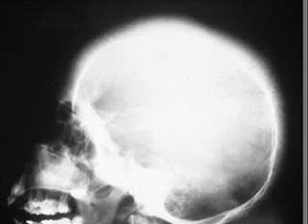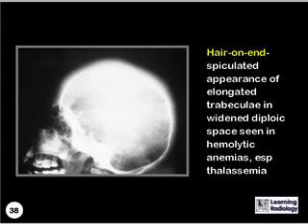What is this called? This is the hair-on-end appearance, which is the spiculated appearance of elongated trabeculae in a widened diploic space, seen in hemolytic anemias, especially thalassemia, but also sickle cell disease.